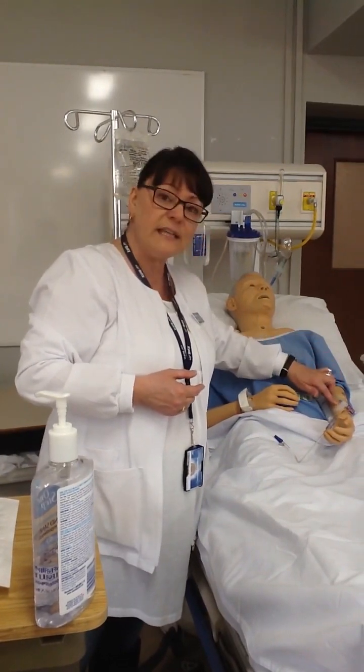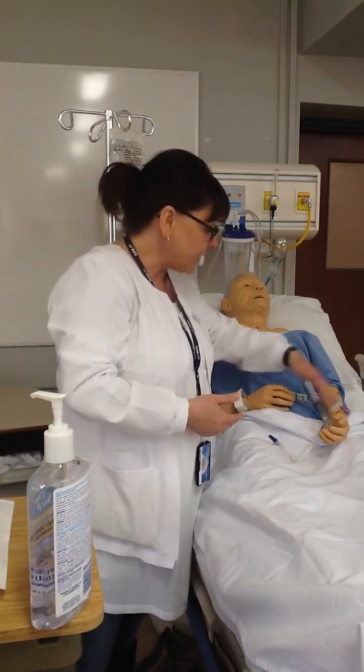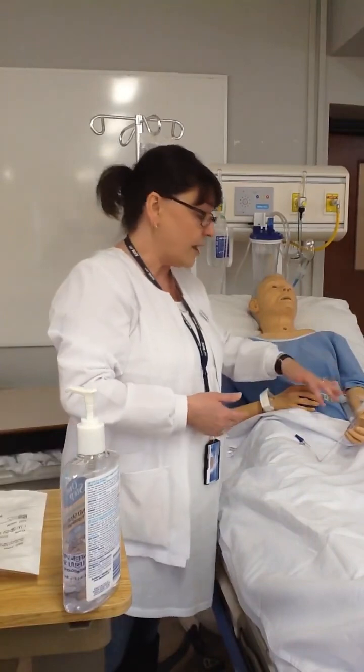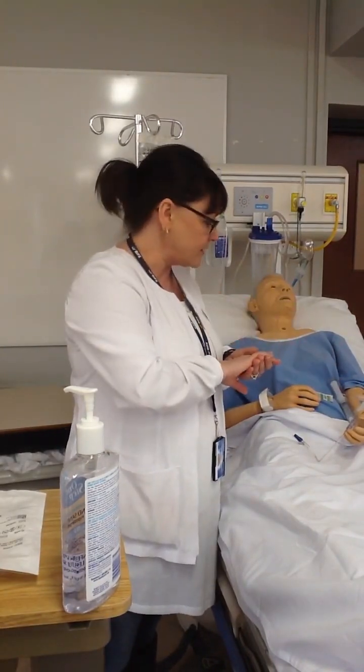I want to see if it's leaking, and of course I want to check for patency if it's not already connected. The fact that it's flowing and dripping tells me that it's patent, and if not, I would be disconnecting and flushing and doing whatever the agency policy is in regards to that.